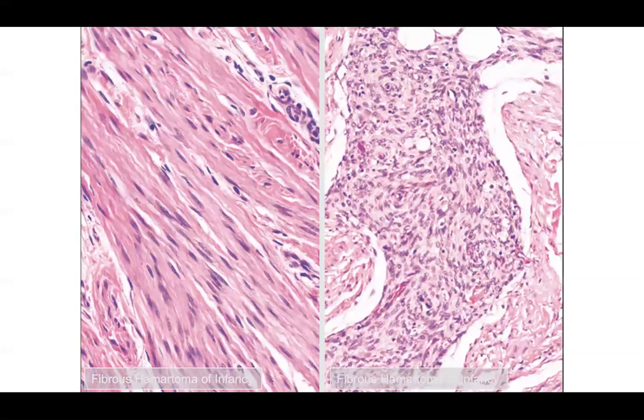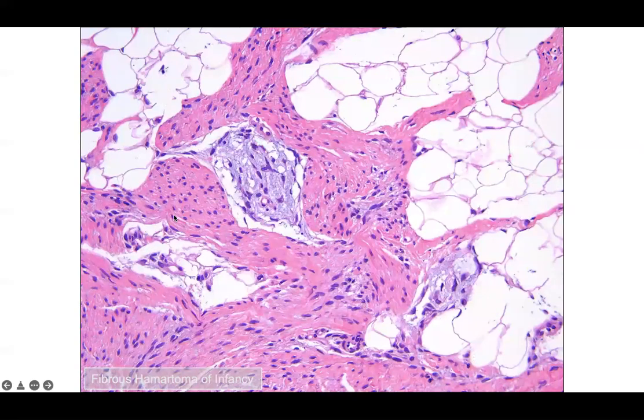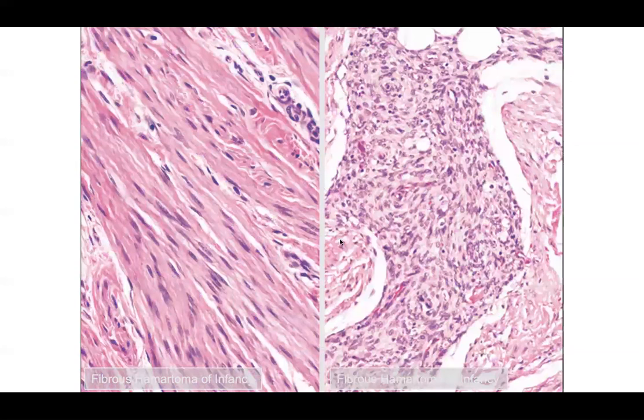Now, if you were looking more at that fibrohistiocytic proliferation area, you're going to just see more of this. It's kind of hard to make that snapshot diagnosis unless you've got all three entities like in this picture. But you should be able to appreciate there is this pretty cellular fibroblastic proliferation. And if you cut it on cross-section, it's going to look even more dense than if you cut it more on a longitudinal axis.